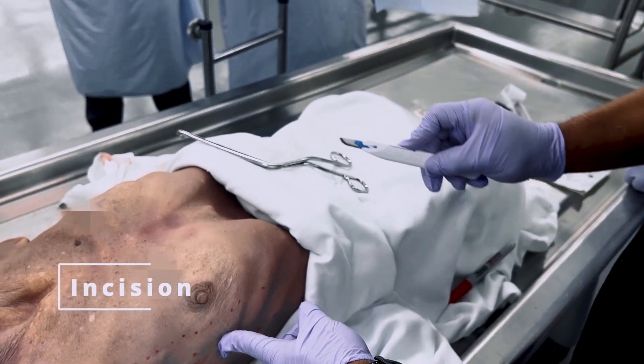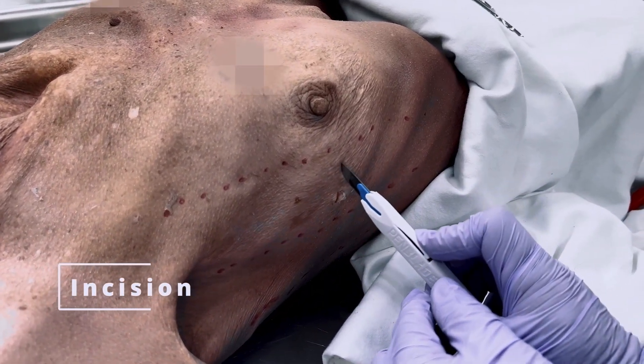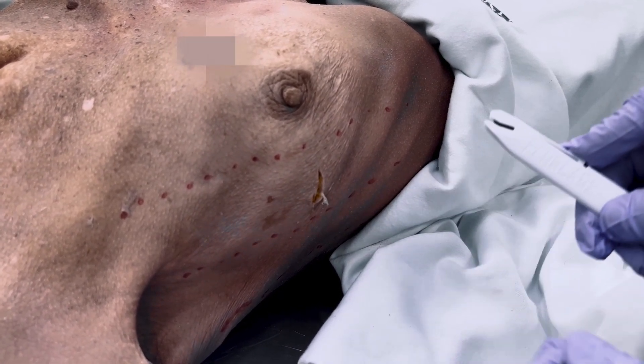Using the number 10 scalpel, make a 1 to 2 inch transverse incision through the skin and subcutaneous tissue, using the middle of the rib like a cutting board.